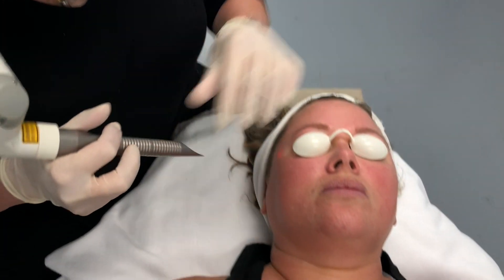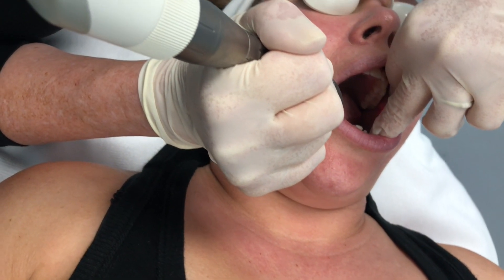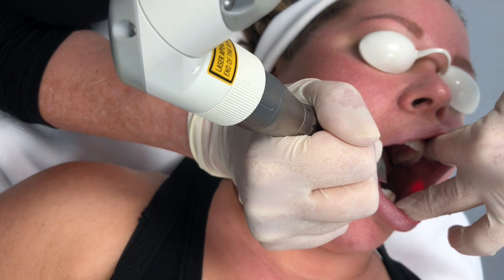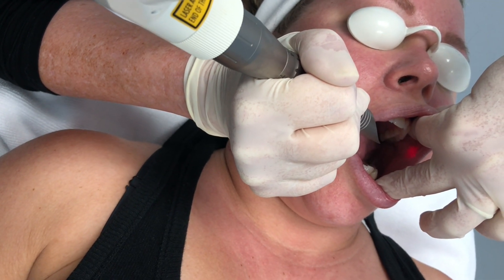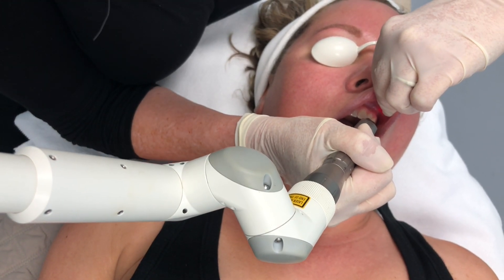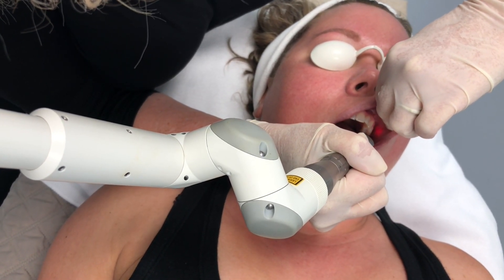We're going to start with the first aspect of the 4D, which is the intraoral. It's going to tighten the tissue from the inside out. We stack four pulses, except when we get close to the lip — there we stack two and then make a second pass. Around the nasolabial fold, I tend to do two passes of two stacks. As you get towards the edge of the lip, it can get a little more sensitive.